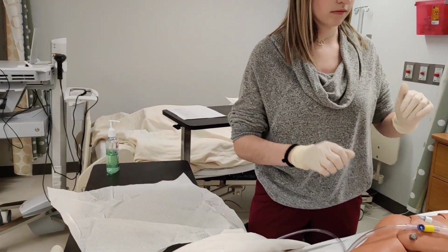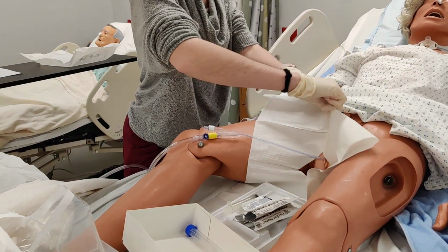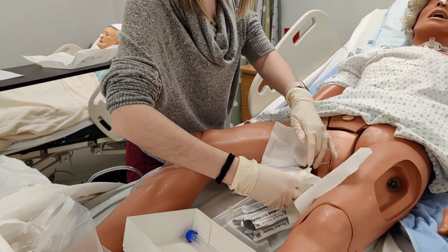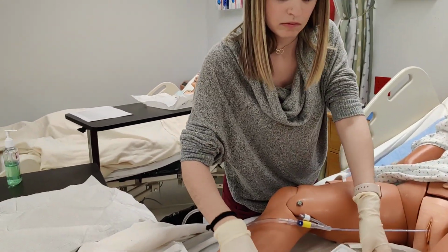All right, and at that point, to remove the fenestrated drape, we would just rip that. Clean up and discard your supplies.